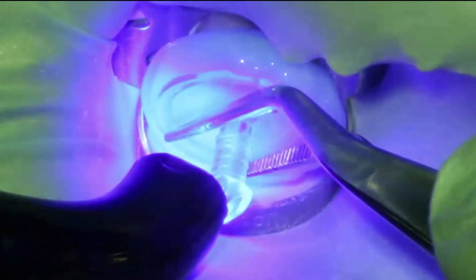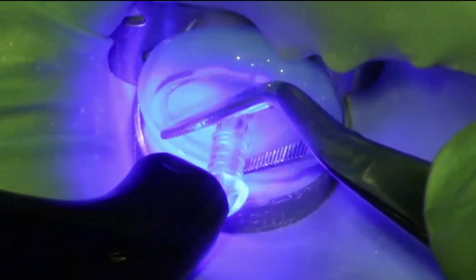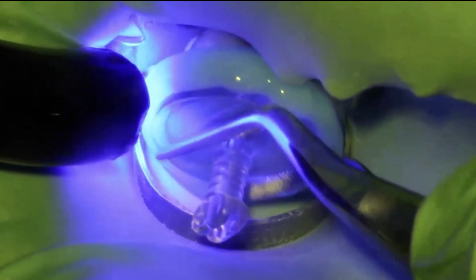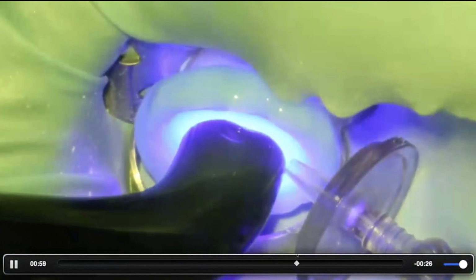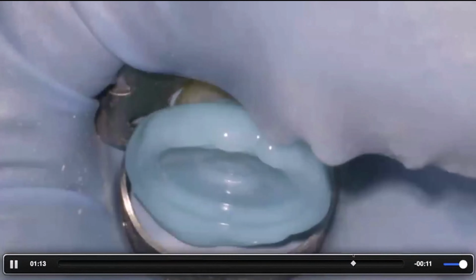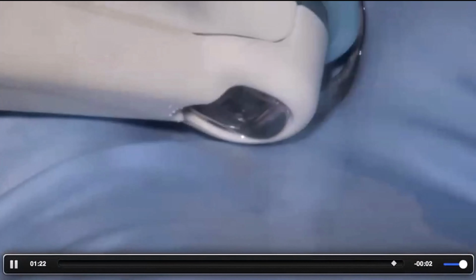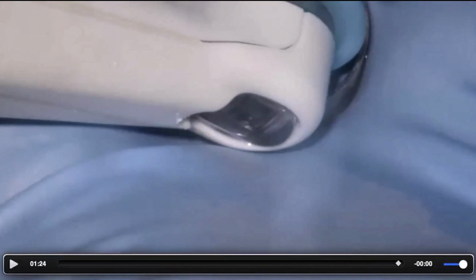seat the matrix, polymerize in multiple areas. Fast forward the polymerization. Okay. Just make sure I have good access there and then run GentleWave. Okay, and it works very well. I do this usually on teeth that have crowns or really certain intact restorations that are not leaking, of course. So it works really well in those cases.